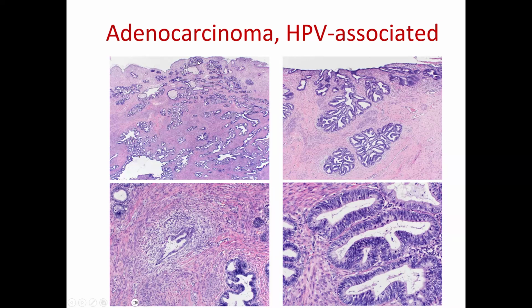How do I measure the depth of invasion if I don't know where the tumor starts from? You hear people talk about that: do I measure from here, where there's a normal gland? Do I assume that the tumor started at this level and measure, or what do I do? It's very confusing. I personally don't think it is confusing at all.